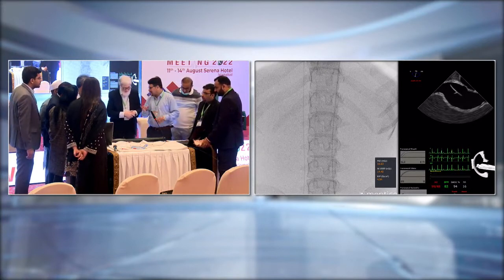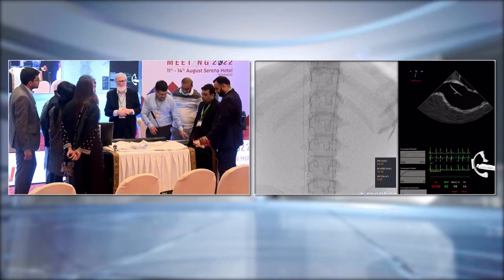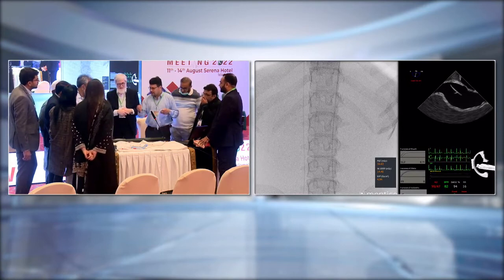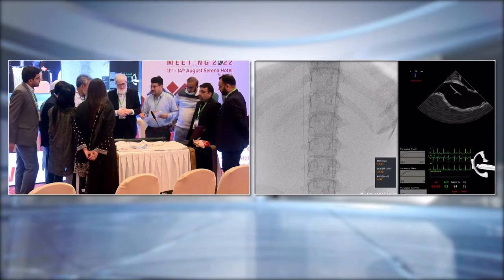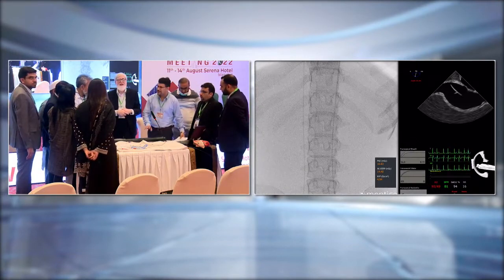Okay, put the wire. I just want to make it clear before this session: this is virtual reality based. There are proper steps to follow because sensors are there. If your technique, your maneuvering or your insertion is not correct, then ultimately the system will not detect it. In real life, you can go at your own pace. So these are some limitations. It's based on expertise level to configure that.